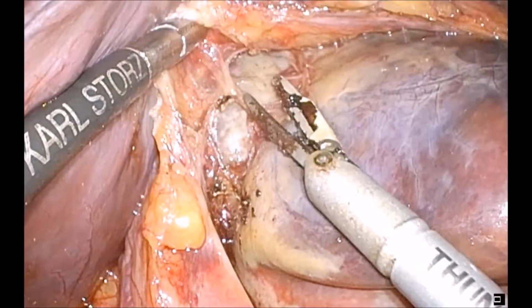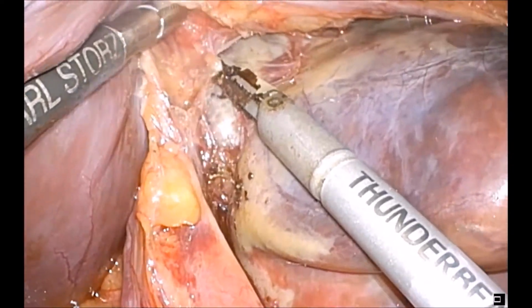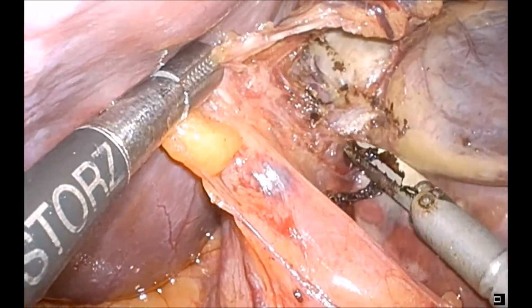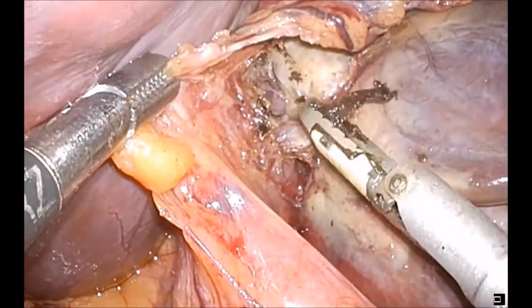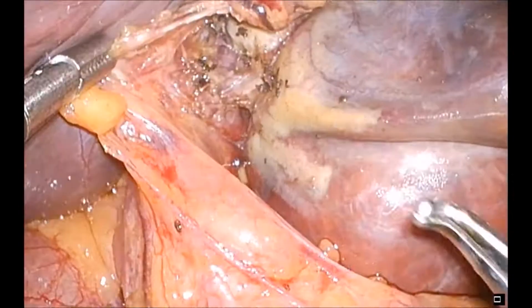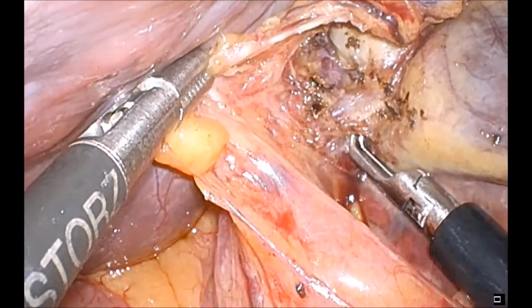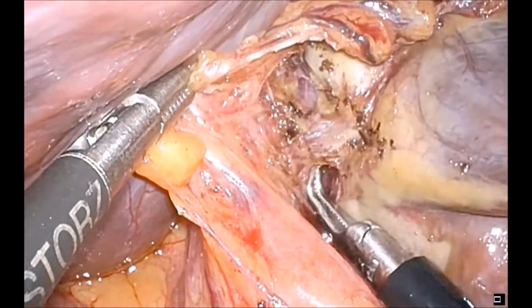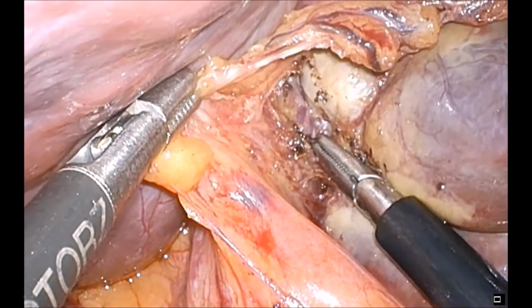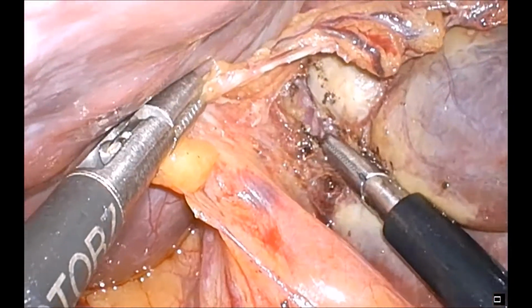The lesser omental dissection continues, now on the undersurface of where that replaced hepatic artery was, and again larger vessels coming from the portal venous structures and the hilum are controlled and dissected.